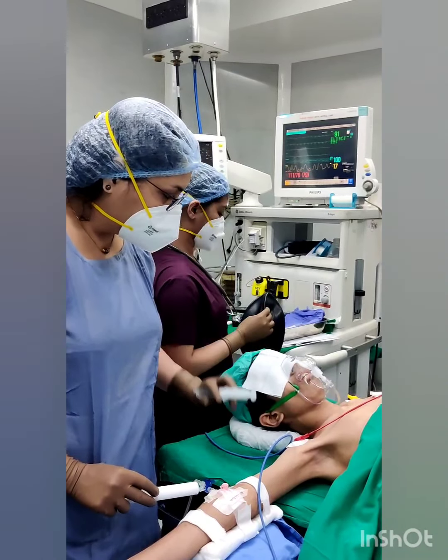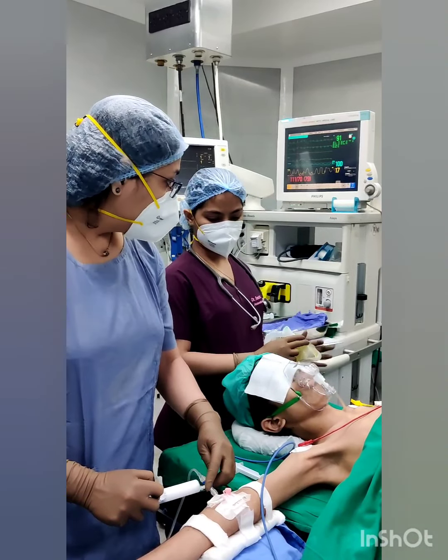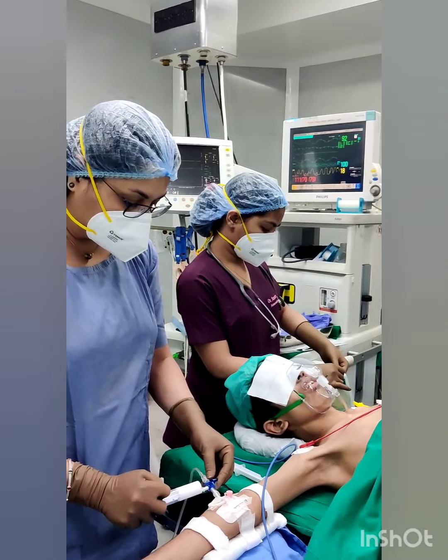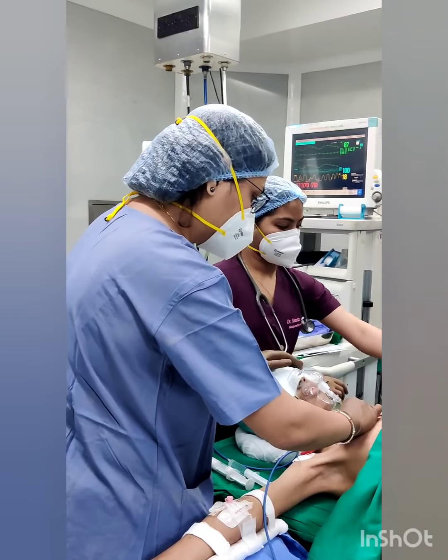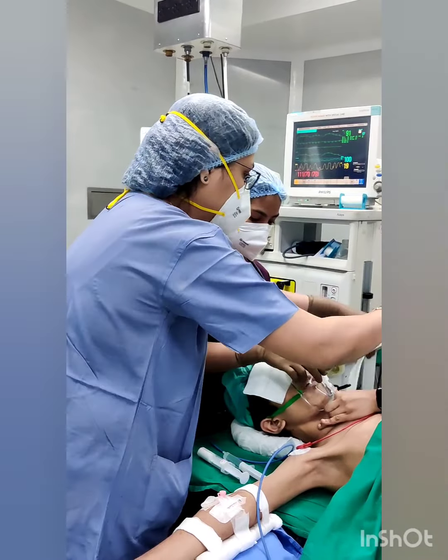Check and secure a patent IV access, apply minimal standard monitoring, keep end-tidal CO2 calibrated and ready for use, and optimize the position of the child and his head at the edge of the bed. Pre-oxygenate, preferably with 100% oxygen for 3 minutes, which helps to wash out all the nitrogen and replace it with oxygen in the lungs and gives us just enough time to intubate. Pre-medicate with IV glyco, 4 micrograms per kg.